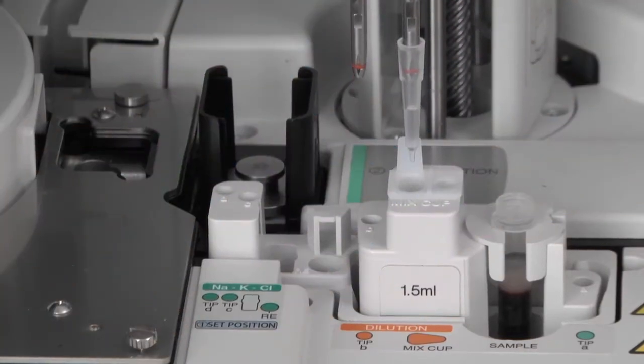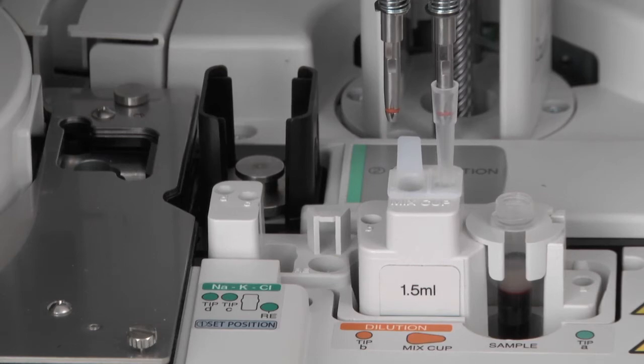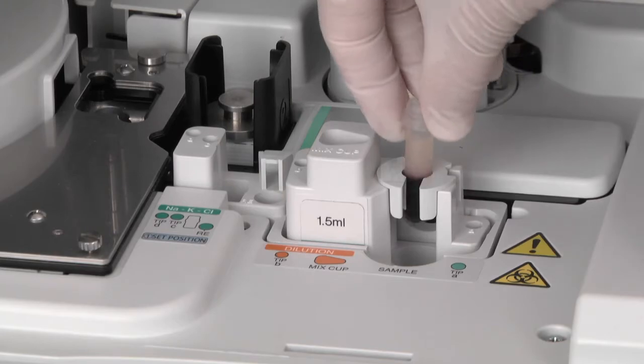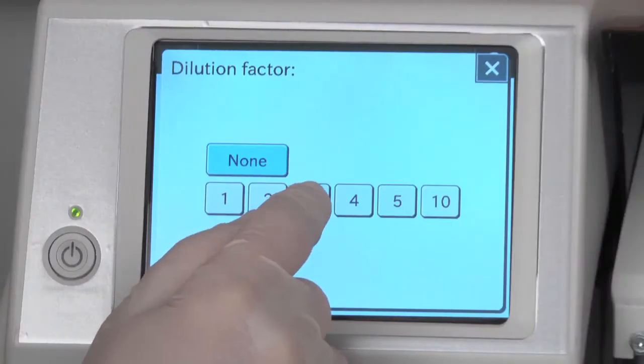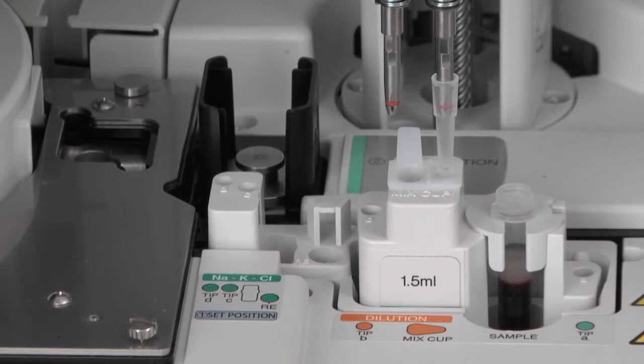For results that are outside of measurable limits, the Element DC offers automated sample dilution, which eliminates guesswork and time-consuming manual steps. Simply set your sample, choose your dilution factor, and the analyzer will automatically perform the dilution and calculate your results.